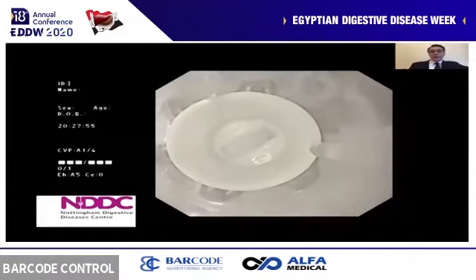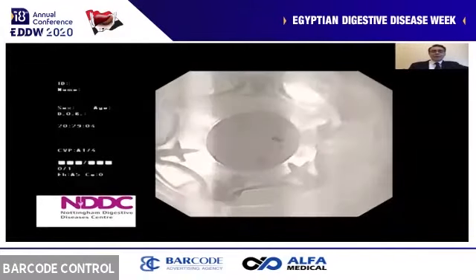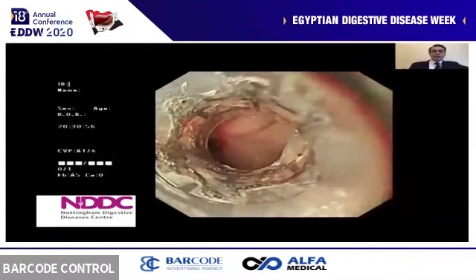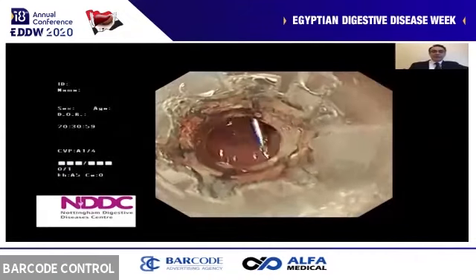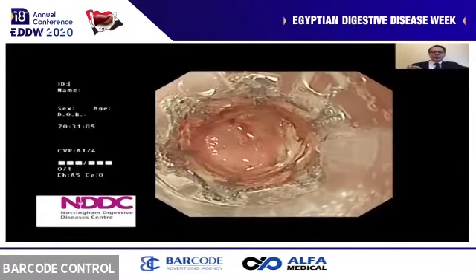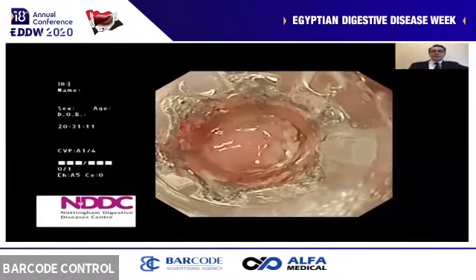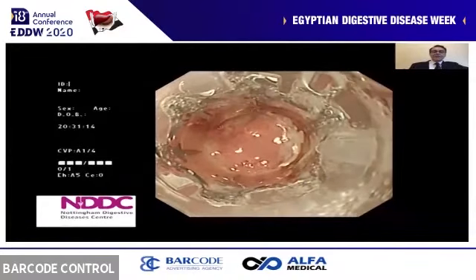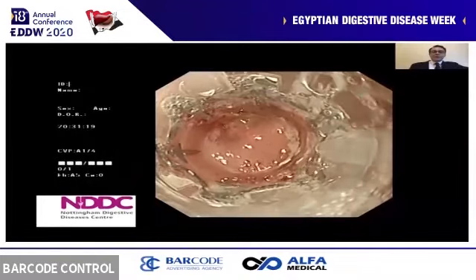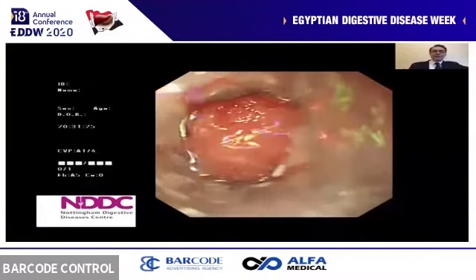In this case, it was a padlock, with which we don't need to use any forceps to grab the tissue. But of course, we have the over-the-scope clip, OVESCO, which was the original one and most frequently used. I don't have any conflict of interest, I must say. That clip had been placed by my colleague who did the first endoscopy to show the area to the radiologist for the embolization. We are targeting the origin of the bleed, the vessel, in more or less the middle of the image. I don't want to get the whole ulcer, just to bring the vessel more or less to the middle of my view.